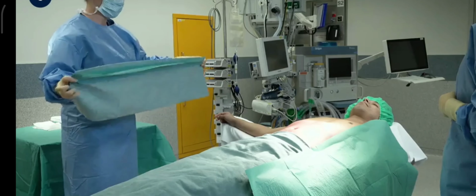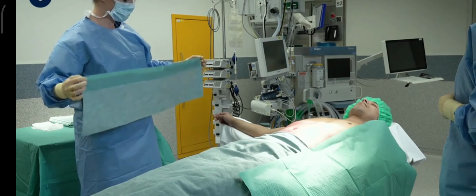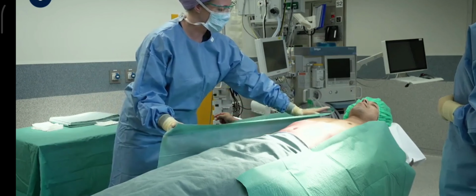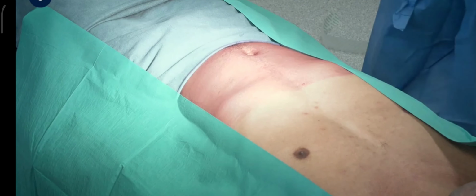In this instance, a little difficulty is experienced, but the scrub nurse waits until the drape is completely unfolded before applying it to the patient's side. Two sides of the square configuration are now in place.